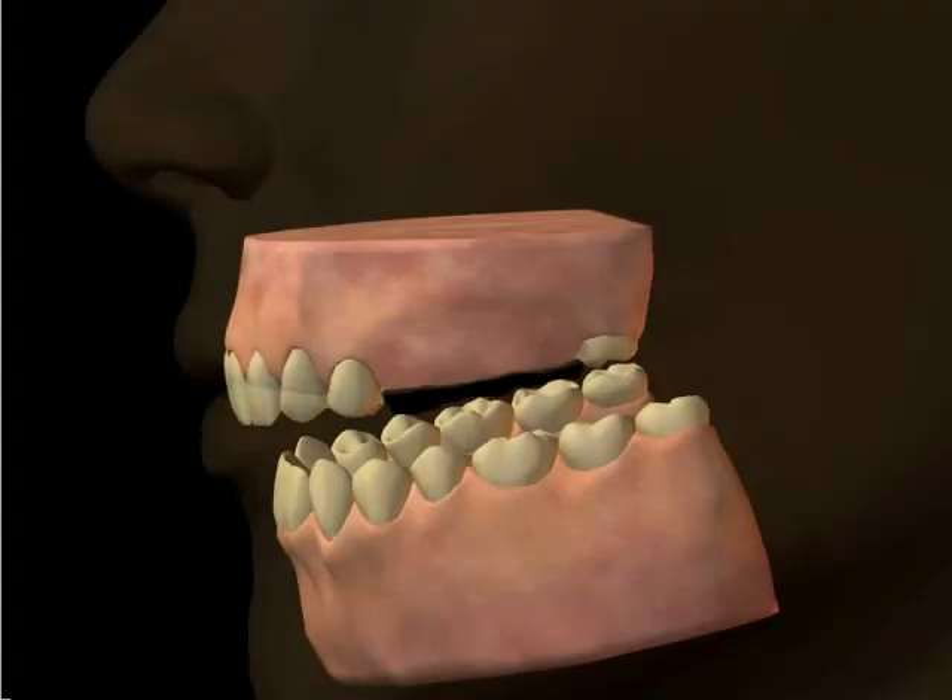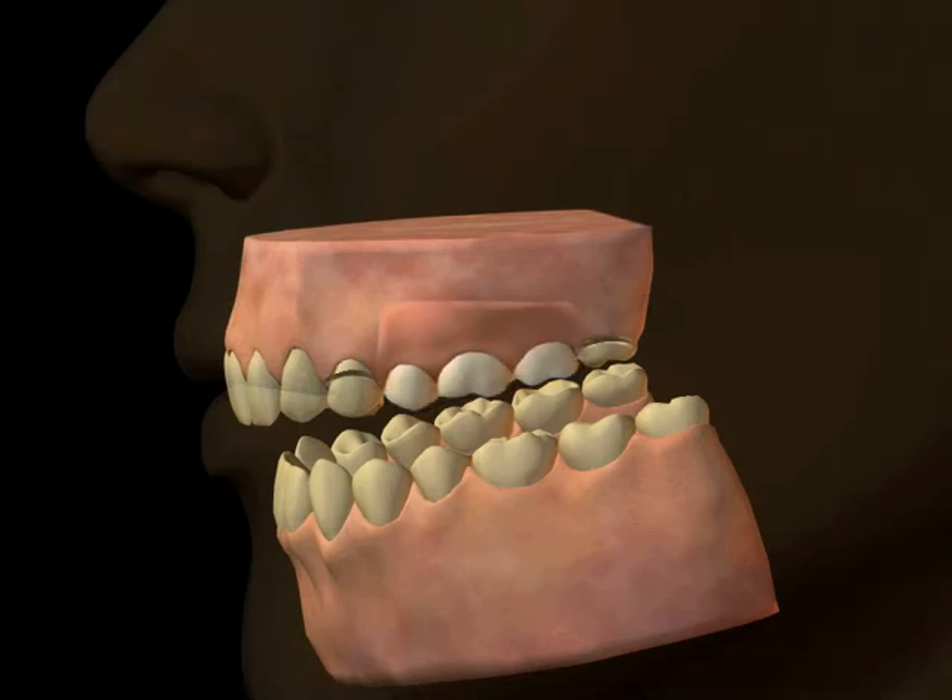In areas having tooth loss, if the remaining natural teeth are strong enough, they can be used to support the attachment of artificial teeth. A removable tooth-supported bridge or partial denture uses clasps or attachments on some of the remaining natural teeth to hold a framework that has the artificial teeth attached to it.